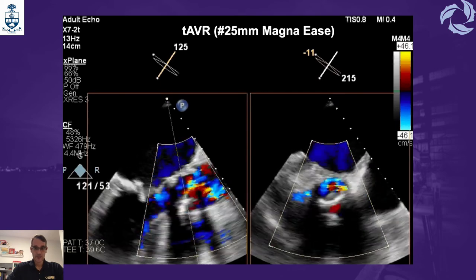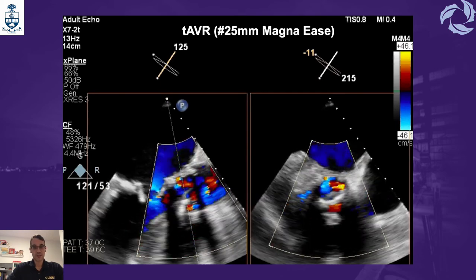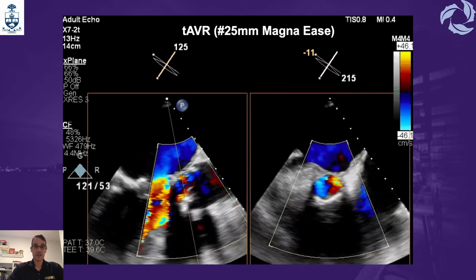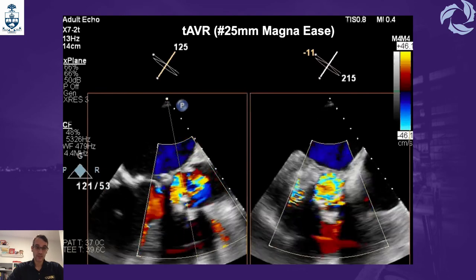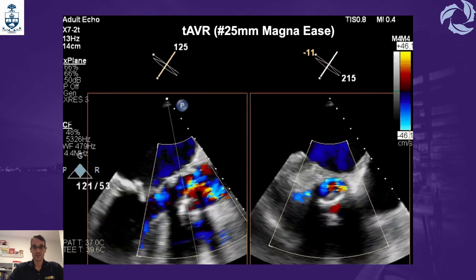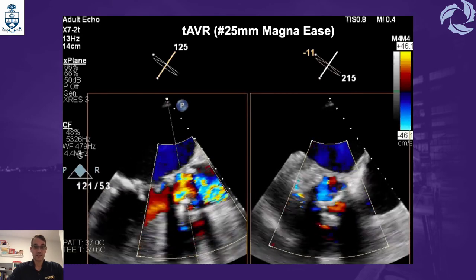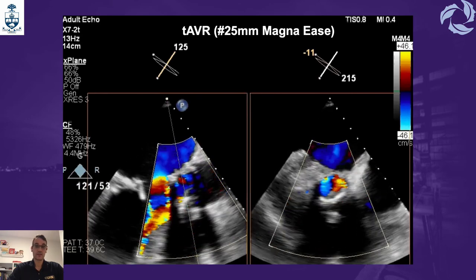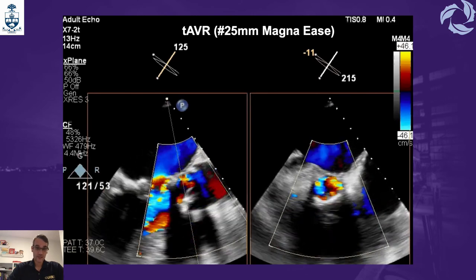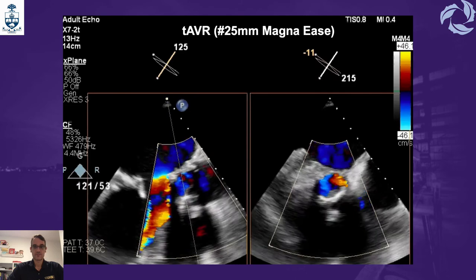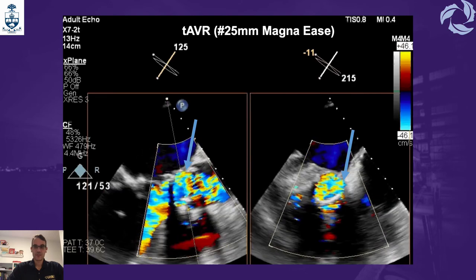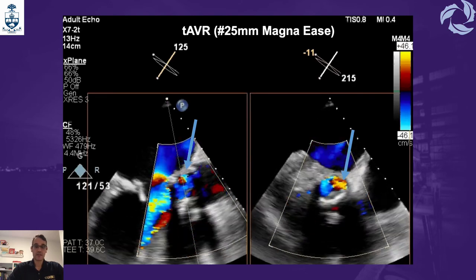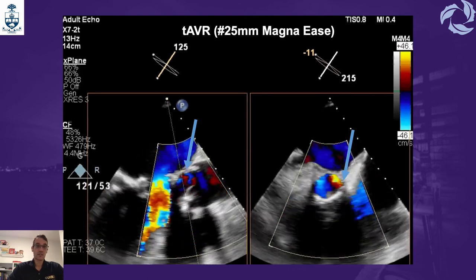For the aortic valve prosthesis, instead of multiplane reconstructions, we can use a simpler 3D tool: x-plane. By using x-plane with color flow Doppler, you can assess in real time the aortic valve replacement in both long axis and short axis views simultaneously. In this case, we can see a mild leak at 8 o'clock with the jet directed towards 6 o'clock.